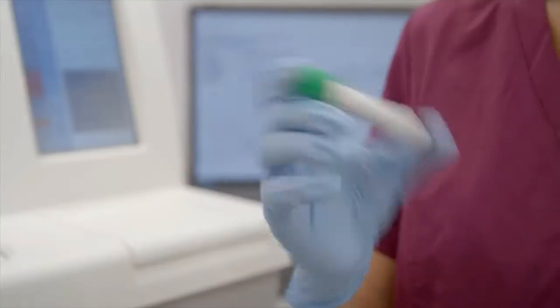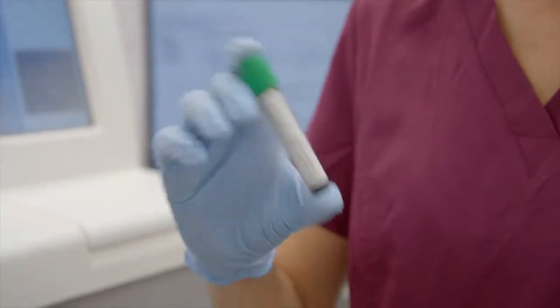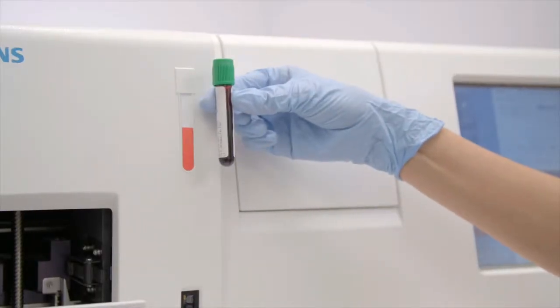To begin, gently invert the collection tube a few times. To determine if there is enough sample, compare the sample level in the tube against the sample volume gauge.